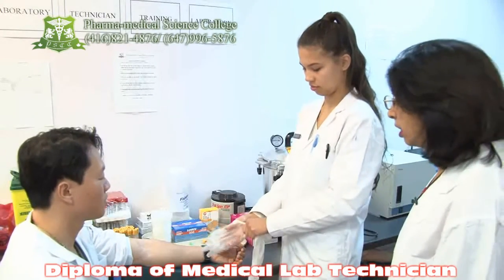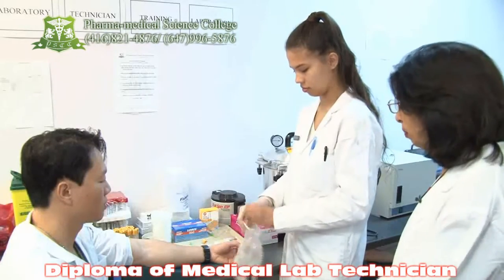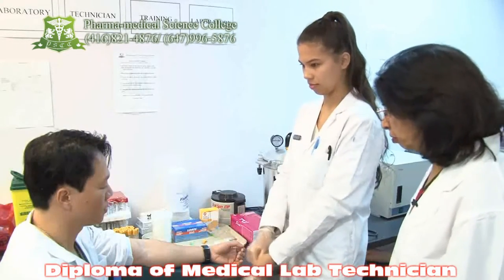Today we are having a phlebotomy class and my student is going to do the act of phlebotomy. We have a patient here. In the beginning, the technician has to greet the patient.